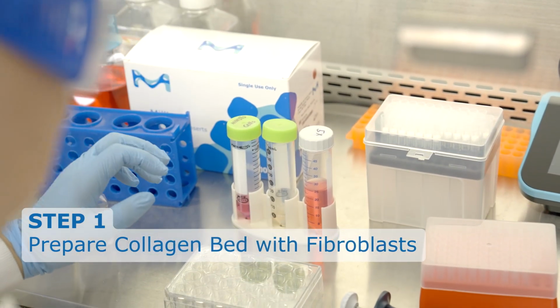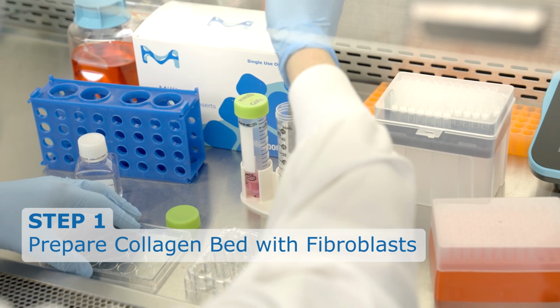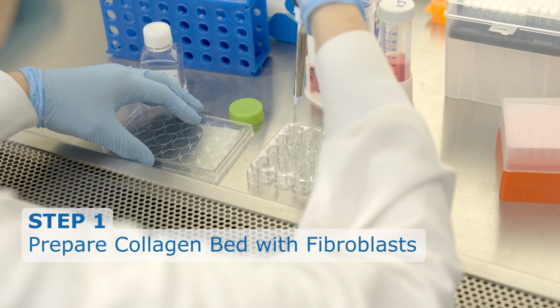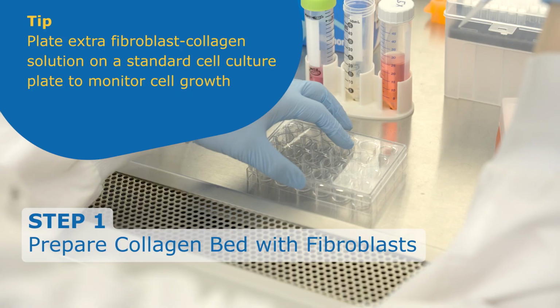Collagen is very sticky and can solidify quickly. The best method is to add the mixture to the middle of the insert while ensuring the tip does not touch the membrane. This ensures an even collagen bed. Polymerize the collagen bed for 30 minutes in the tissue culture incubator.